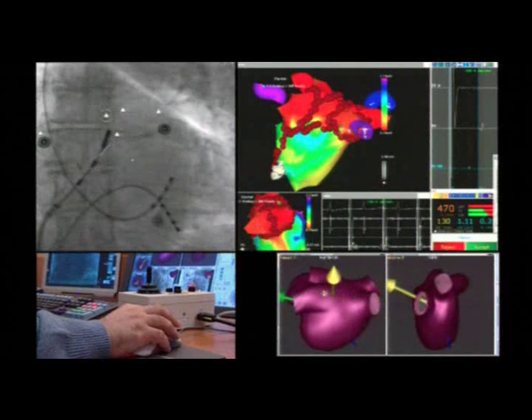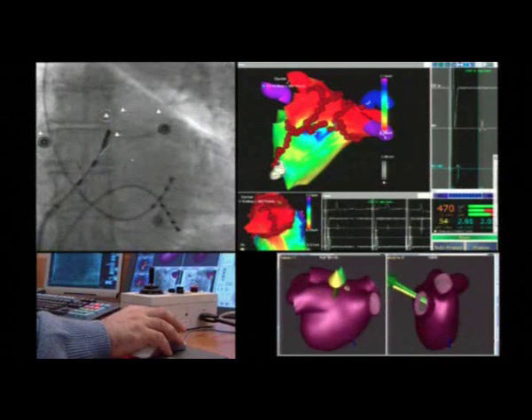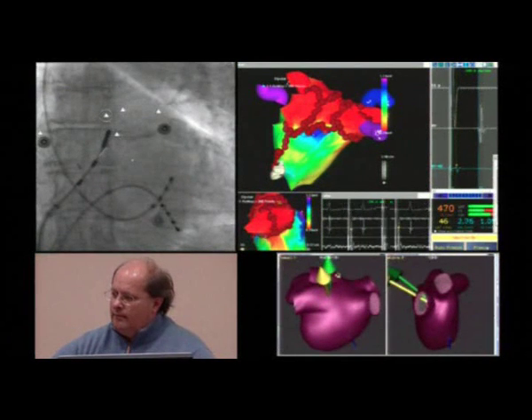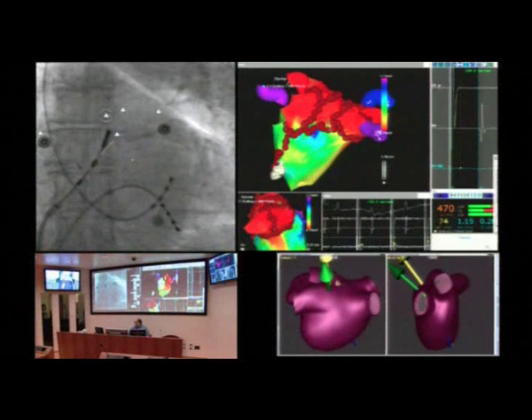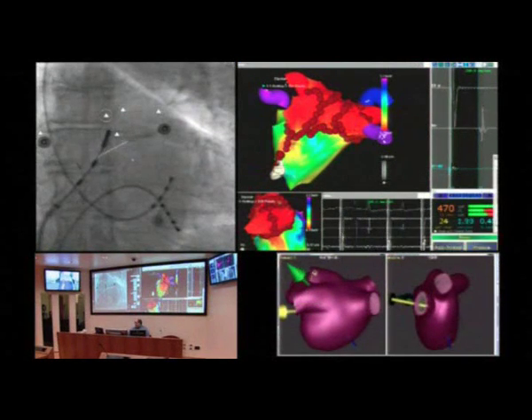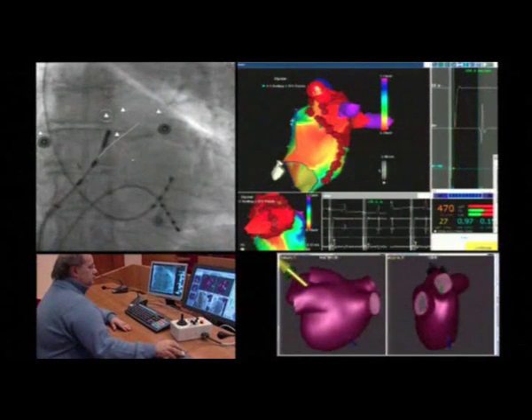A unique feature of this navigation system is the possibility to store the spatial coordinates of multiple points together with their own positioning vectors. With this method it is thus possible to re-navigate with unparalleled precision to the same points before and after ablation, establishing with absolute anatomical precision the electrophysiological modifications induced.